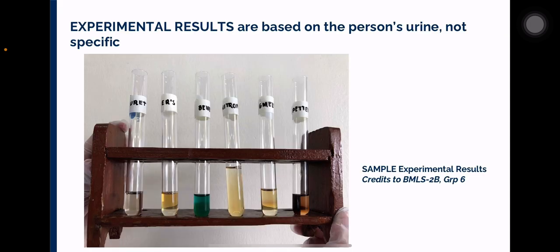So this slide shows sample outcomes from actual student experiments. So I have just an important reminder to each one of you. The results will really vary depending on the individual's urine composition. So always compare visual results carefully with the expected reactions.